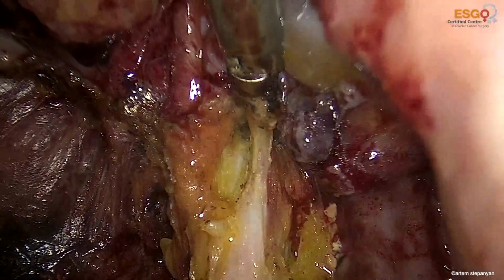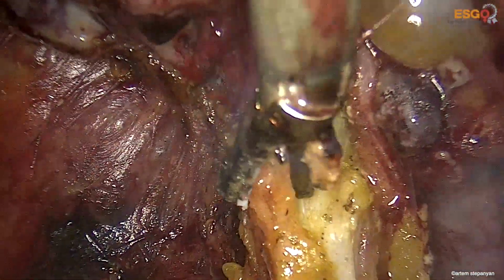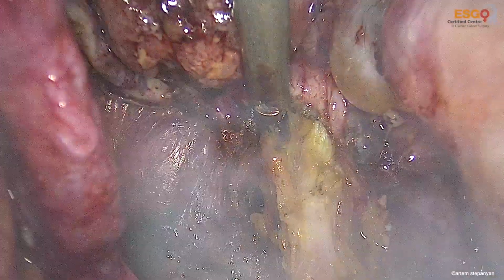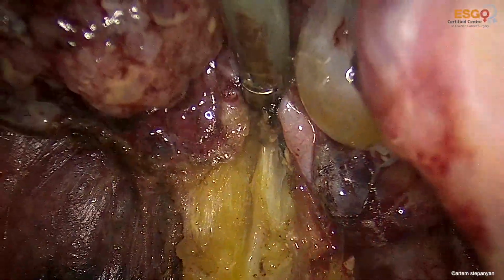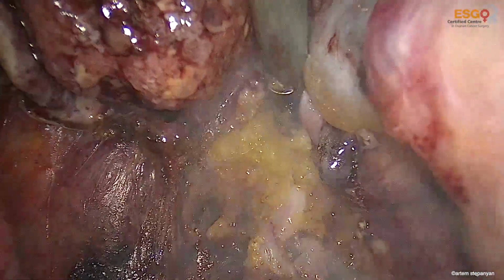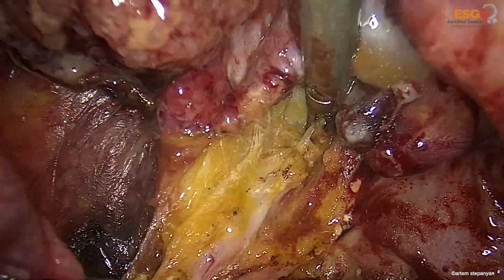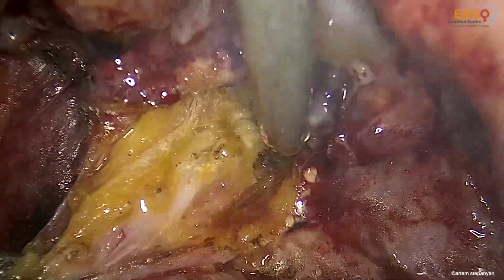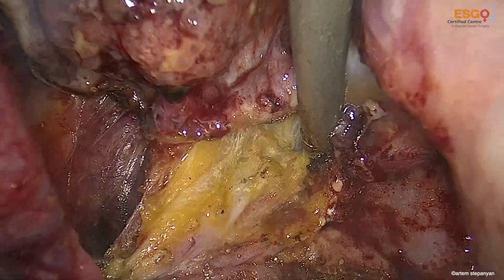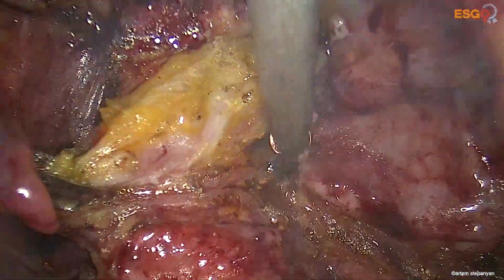So we're combining the traction, counter traction to obtain the good anatomical planes for the dissection. It is important to have a good control over the rectum to avoid the rectal injury at this step of the procedure.